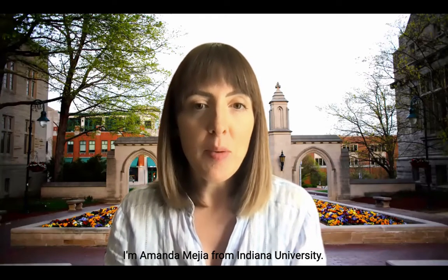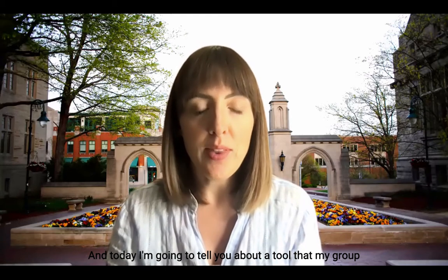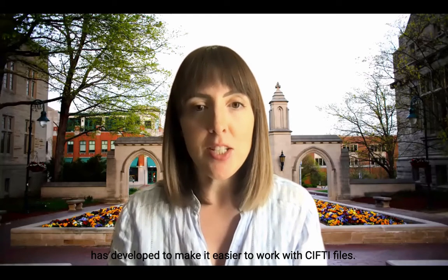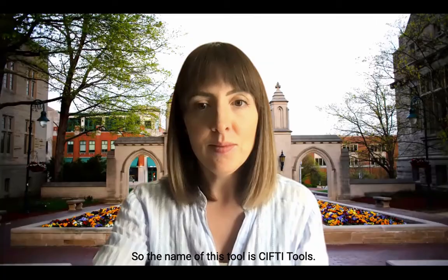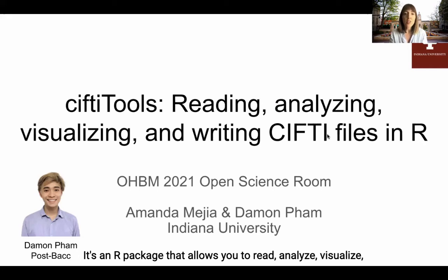I'm Amanda Mejia from Indiana University, and today I'm going to tell you about a tool that my group has developed to make it easier to work with CIFTI files. The name of this tool is CIFTI-Tools, and it's an R package that allows you to read, analyze, visualize, and write CIFTI files all in one place.